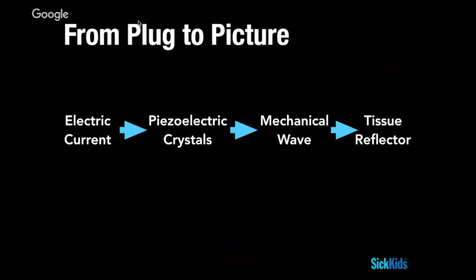Often they're types of crystals, and the original version of this that made it into electrical devices was quartz. So quartz watches, if you wound a spring that put pressure on a crystal, it could generate electricity for you. So the first digital watches operated under that before they all became battery powered.